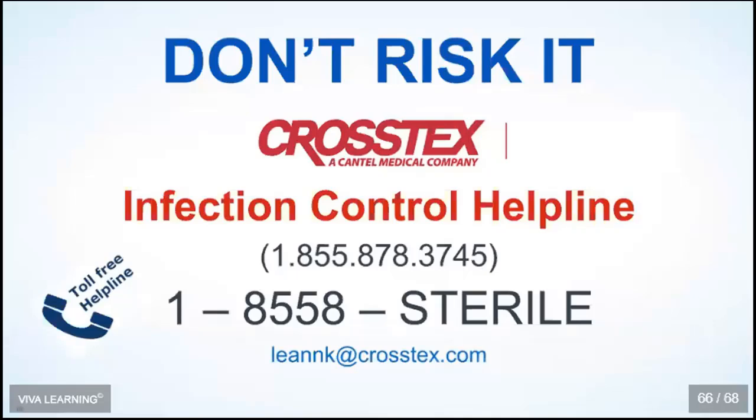How do you keep your packs standing? There are what they call original manufacturer racks, original equipment racks that come with the sterilizers, or you can buy from your dental dealers racks that will sit on top of the trays in your sterilizer to keep them positioned appropriately. Something I forgot to mention, when you use those racks, it all has to be plastic facing one way or paper facing one way. They can't be alternating because you don't want paper to paper to be able to touch. So all plastic forward or all paper forward.